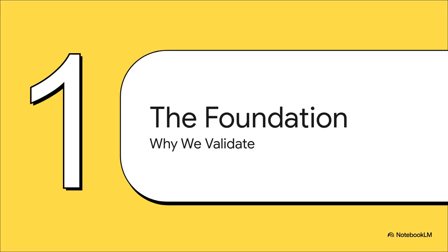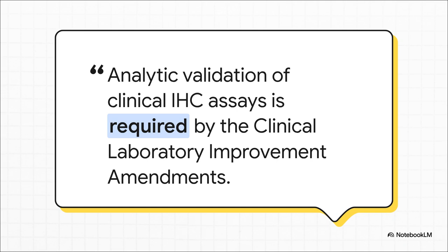Okay, first up, let's lay the groundwork. Why do we even do this? It's not just about ticking boxes or doing good science. It really comes down to patient safety and, honestly, the law. Yeah, let's be super clear about this. This isn't a suggestion. It's not a best practice. It is a federal requirement under CLIA 88. Every single lab has to prove its tests work the way they're supposed to before they're ever used to make a clinical decision. This is the absolute bedrock that protects our patients from bad results.